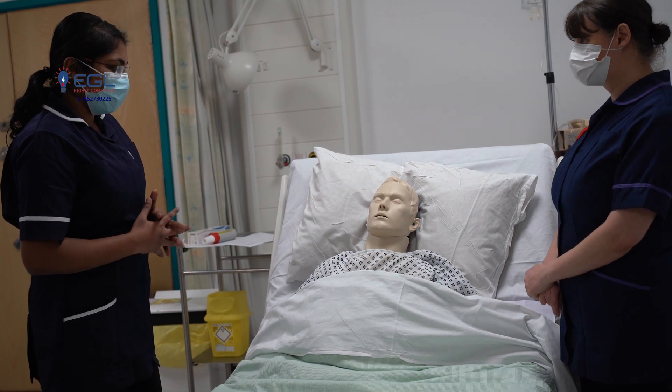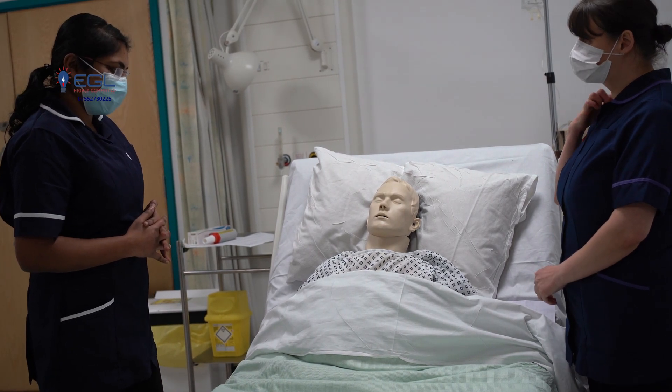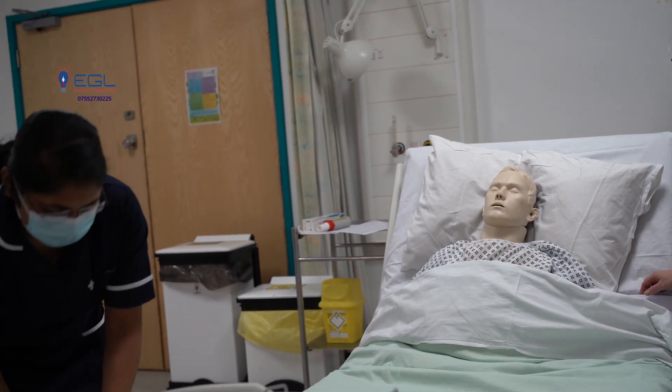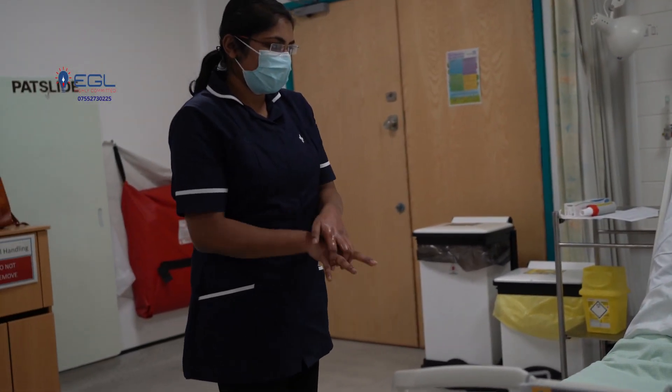Are you comfortable in this position? I am. Thank you. I will now gel my hands according to WHO guidelines.